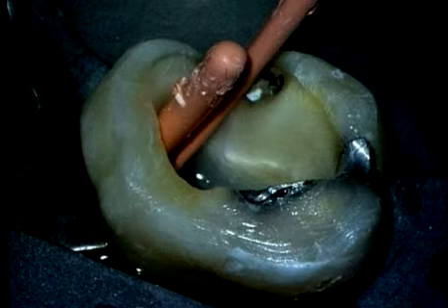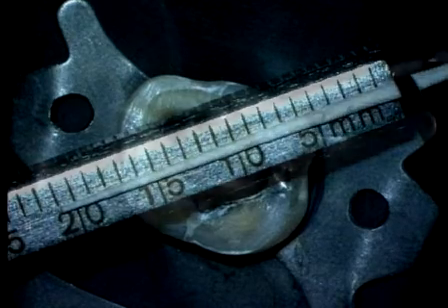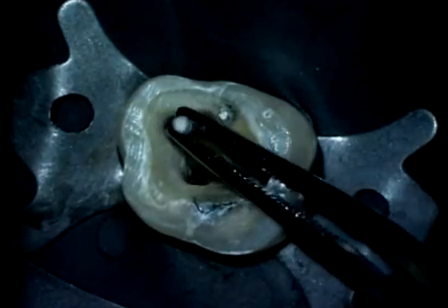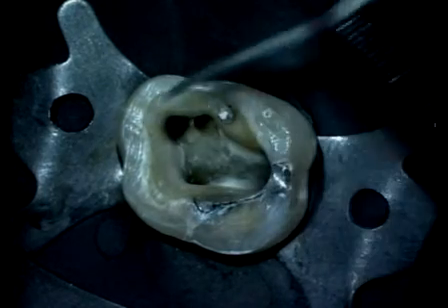After removing intracanal irrigant using the aspirating syringe, select a prepackaged fully tapered paper point. Paper points are carefully measured at the exact working length. Paper points are gently placed into the canal. The paper points are swirled. This more effectively wicks moisture from the root canal space.